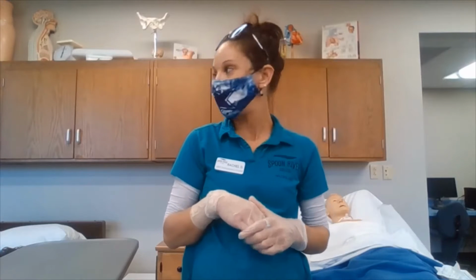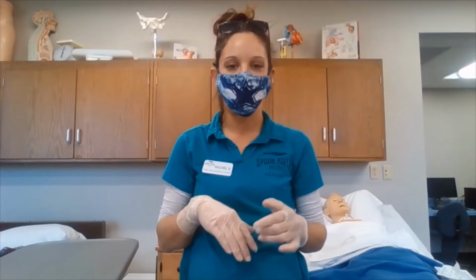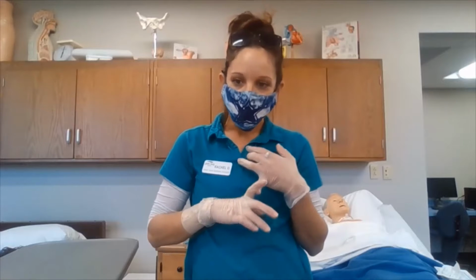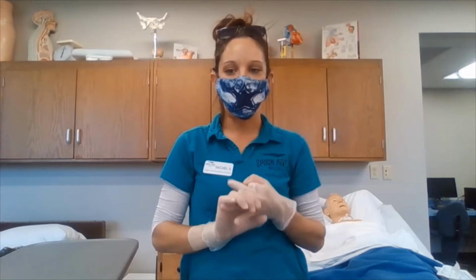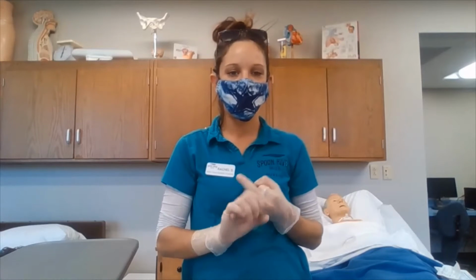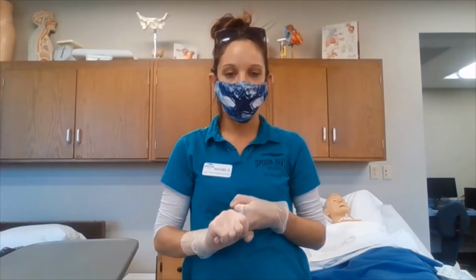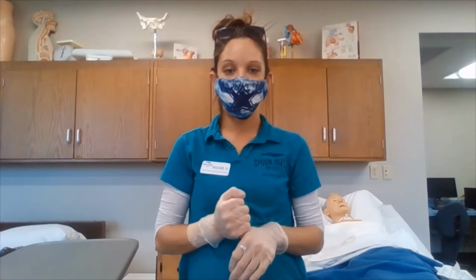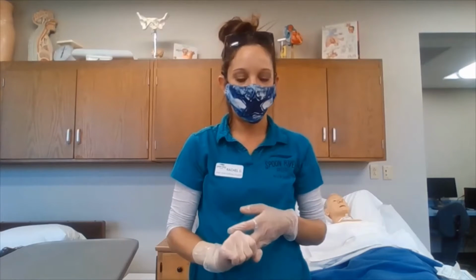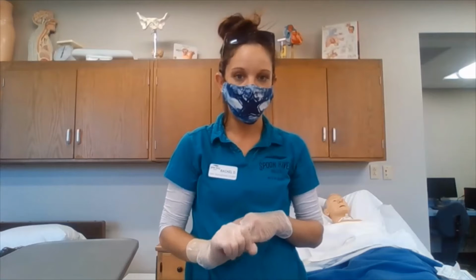Our other supplies are going to include tape, a 60 milliliter Toomey syringe, water soluble lubrication. We're going to need a stethoscope, a tongue depressor, our pen light, a rubber band, a safety pin, a cup of water with a straw, and pH strips.